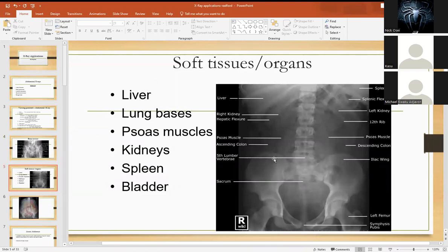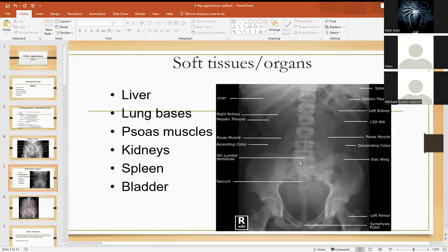Now let's start from the bone. If you take the pelvic bone and count the vertebrae on it, knowing that the lumbar spine has five vertebrae, the one that is on the sacrum or on the pelvis should be L5. So even if it's not labeled, the one on the pelvis is L5, the next one above it will be L4, the one above that L3, and so on. So if I'm looking for L3, I just count upwards: L5, L4, L3 — and then I identify my L3.